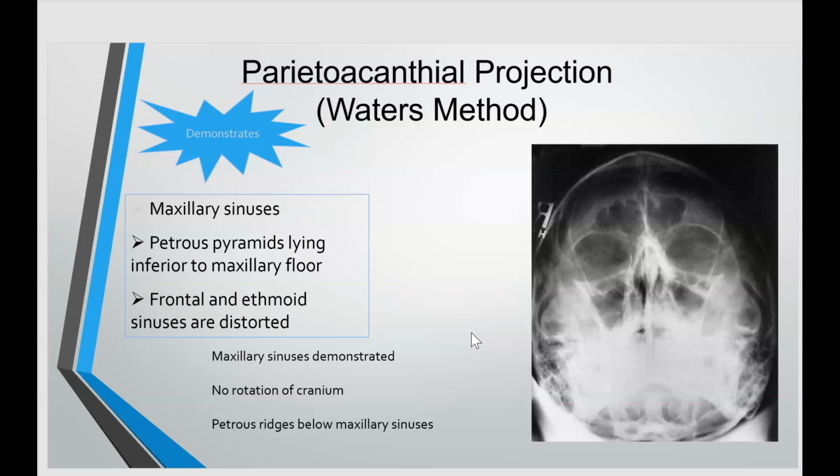Okay, you want to ensure that there's no rotation of the cranium. And lastly, those petrous pyramids really need to be below the maxillary sinuses for this to be diagnostic for your radiologists.